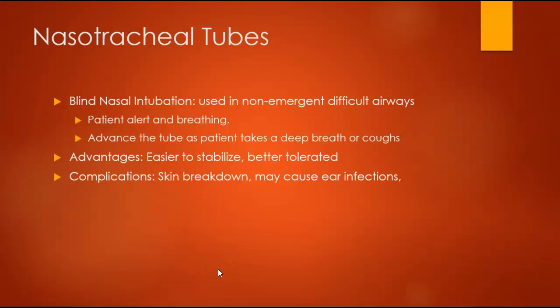Okay, so nasotracheal tubes are an alternative to oral tracheal tubes. We rarely use nasotracheal tubes. Typically, we're doing this for blind nasal intubations for non-emergent difficult airways.